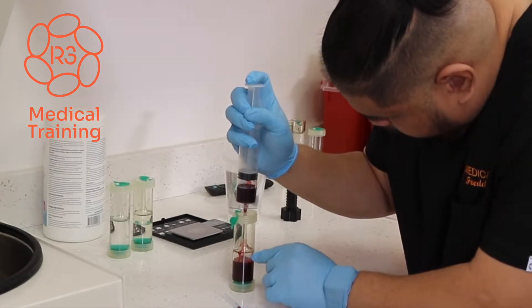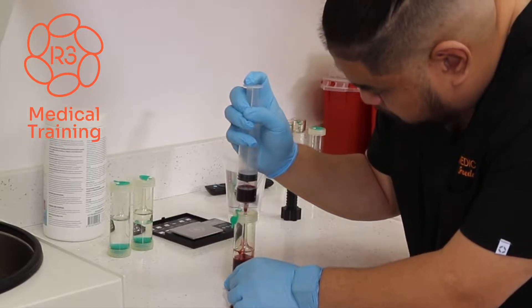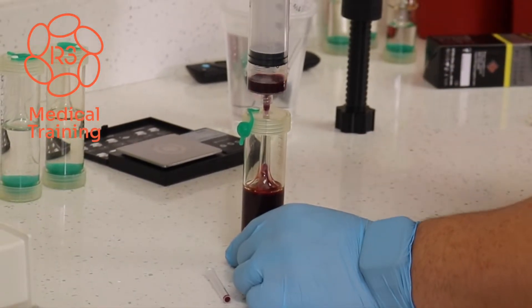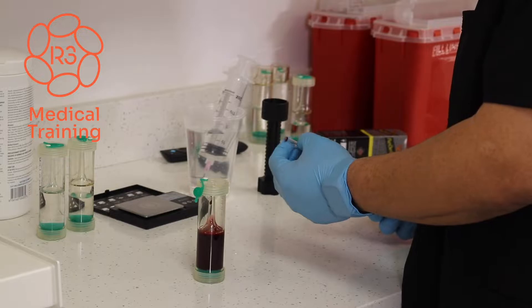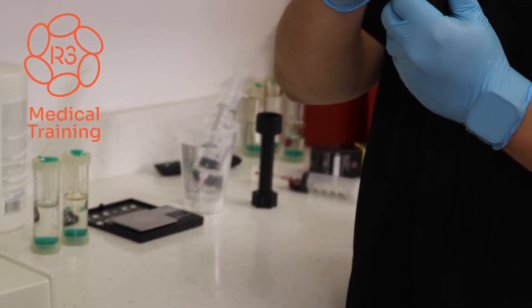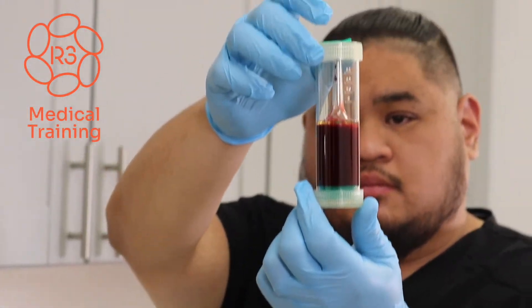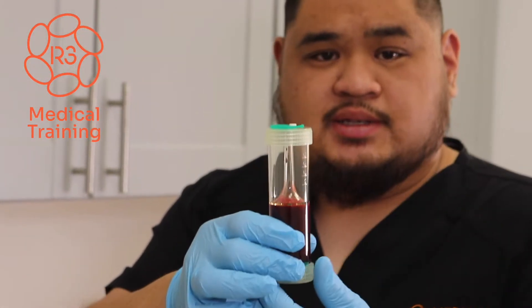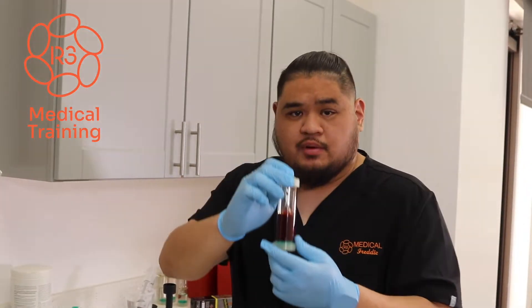I'm going to keep going until I hit the 30 cc marker right here, and that will let me know that I've completely filled up the 30 cc rubella PRP kit. And I've hit that mark, so we have the rest of the blood I'm going to put away. When you're done filling it, it should look something like this. Prior to putting this in the centrifuge for the centrifugation process, place the rubber capper back on.